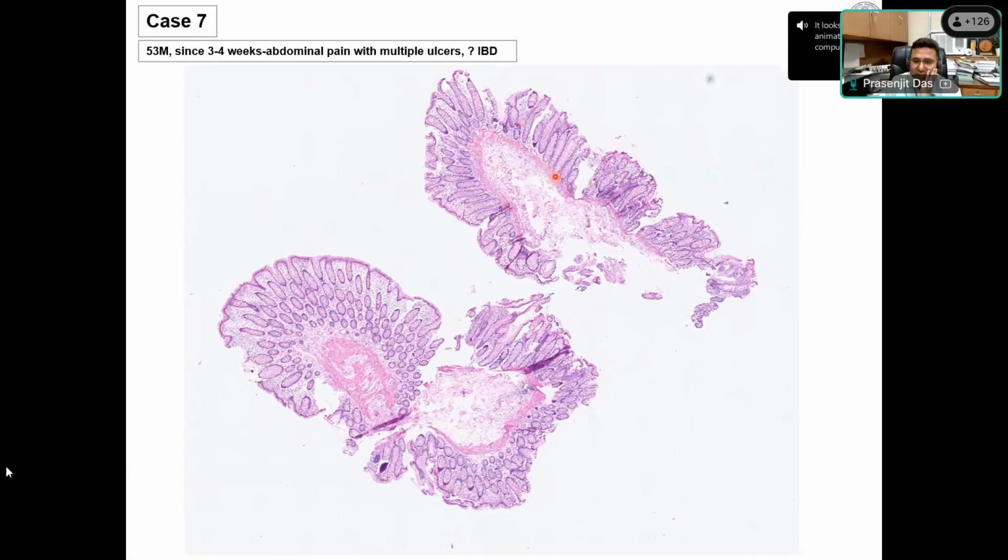They are pinching on the muscularis mucosae. Look at this area, slightly distorted. Look at this area, you yourself told the crypts are elongated. Here also there is some attempt at branching. Here also you can see side branching. So there is some patchy chronicity. Though inflammatory cells are not there like what you have seen in many pictures already, so possibly some patchy chronic disease.